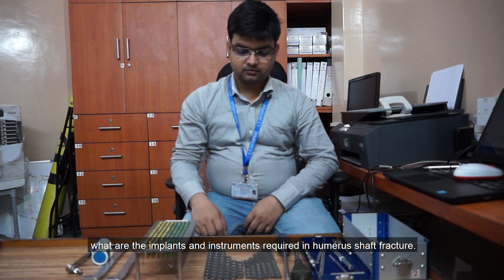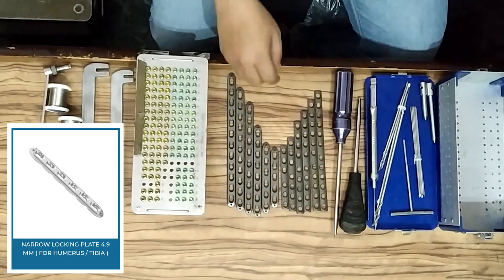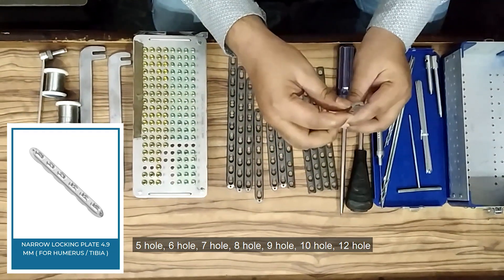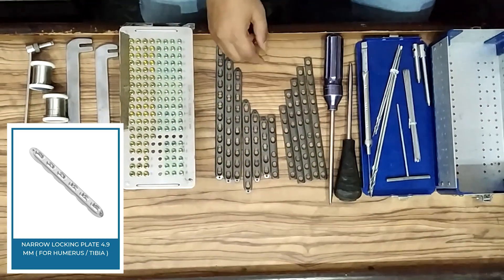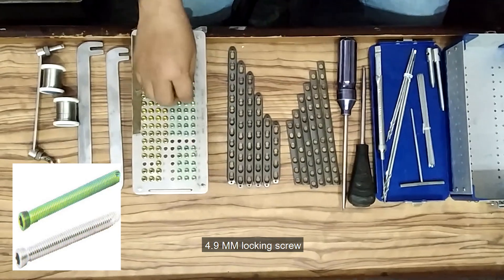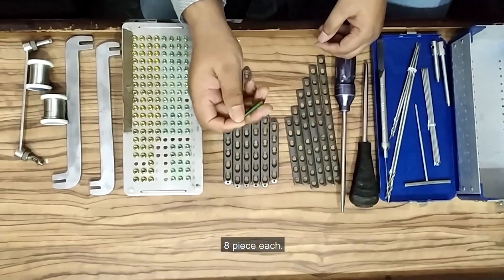Now let us discuss what are the implants and instruments required in humerus shaft fracture. Narrow DCP locking plate and non-locking plate: 5-hole, 6-hole, 7-hole, 8-hole, 9-hole, 10-hole, 12-hole — one piece each for both narrow DCP locking plate and narrow DCP non-locking plate. 4.9mm locking screw, 20mm to 30mm: 8 pieces each.